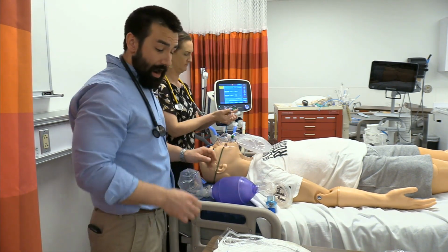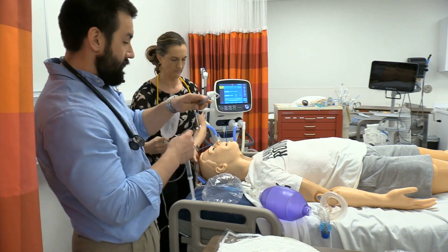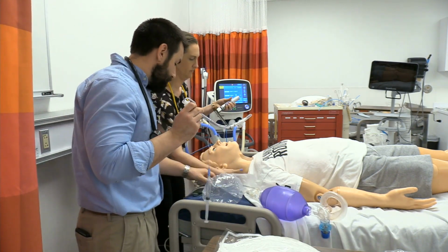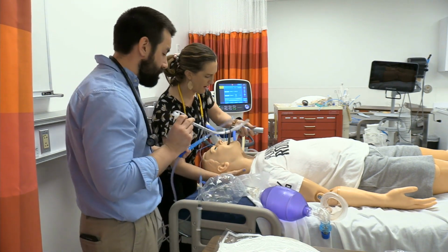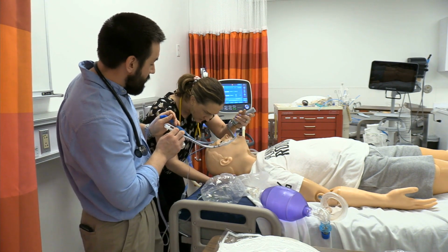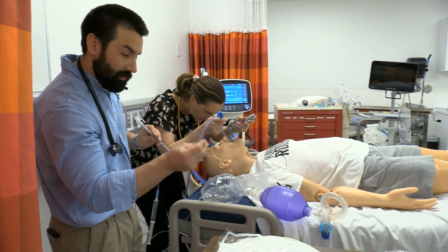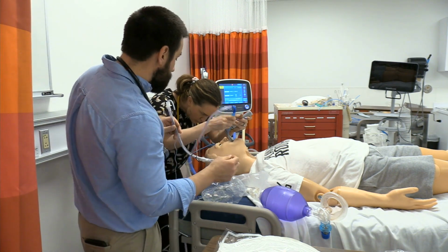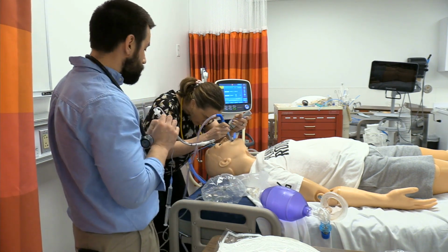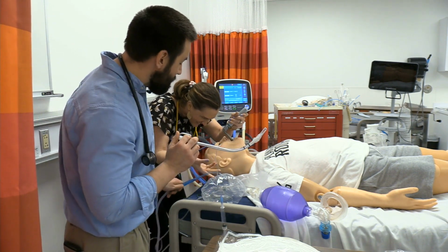It looks like they are out here. Are you ready? All right, let's go. So just let me know whatever you need, and let's do this on the first attempt here, okay? We'll try. I'm a first year. I'm trying to kind of think about her needs here. Suction, please. All right, got your Yankauer on. I got it set up where I'm handing it to her at the right orientation. She just go in. I don't know why she makes that noise while she suctions. Some doctors are strange like that.